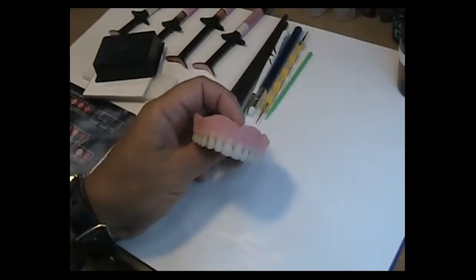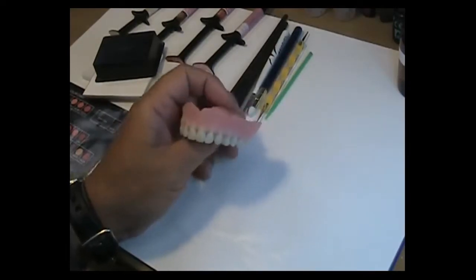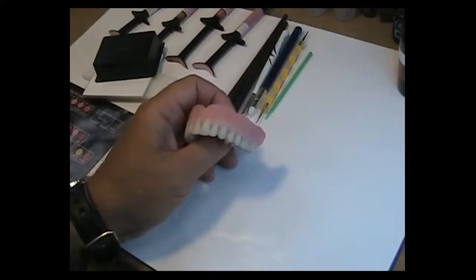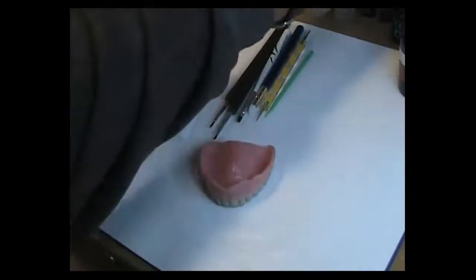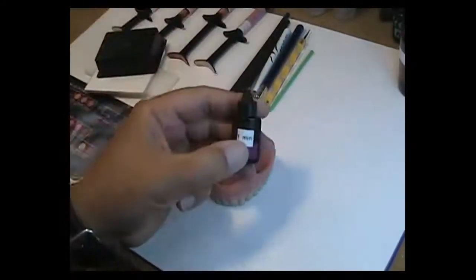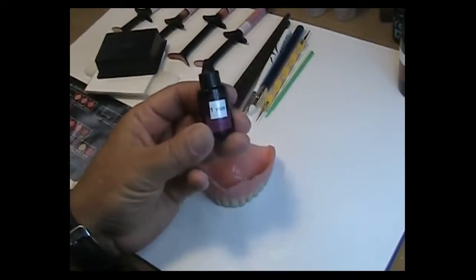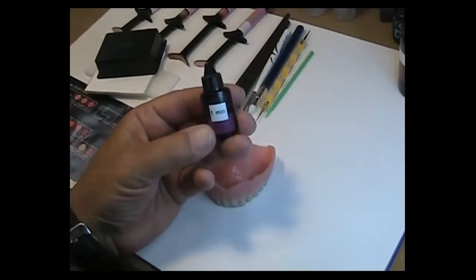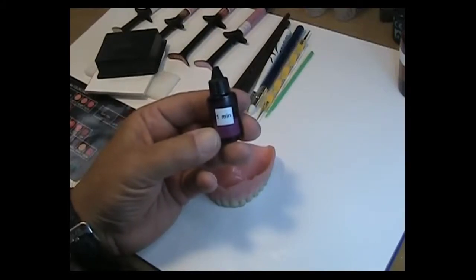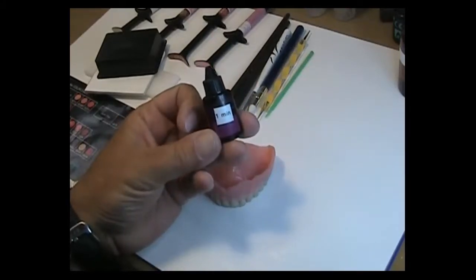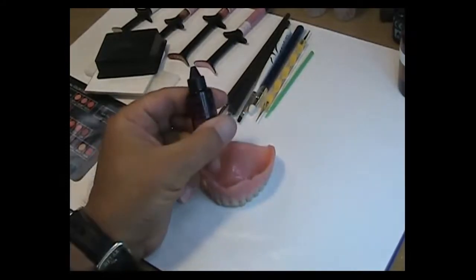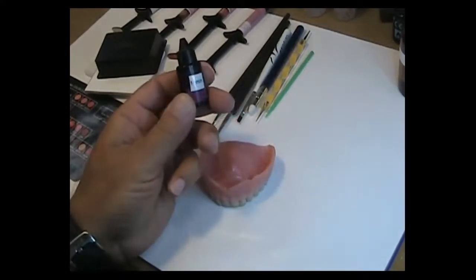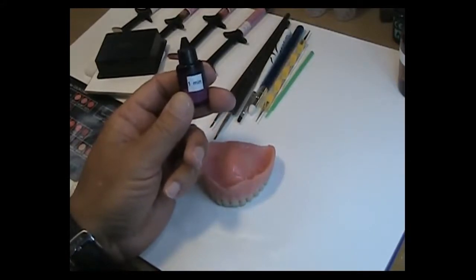The next step would be the composite primer because in order to get the composite material to stick on PMMA you have to have some sort of bonding layer and that bonding layer is provided by the composite primer. I mark a lot of my bottles with the curing times I use just like a little label maker and I'll put the actual time that it needs to be cured. In this case for the composite primer it's one minute. So I would put a coating of this material on my denture base and then cure it.